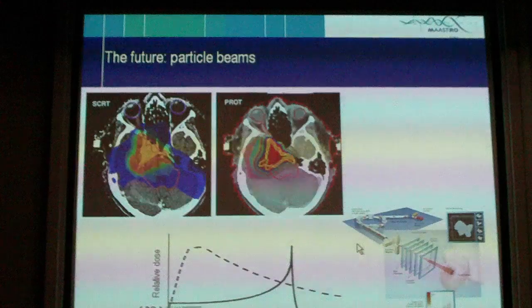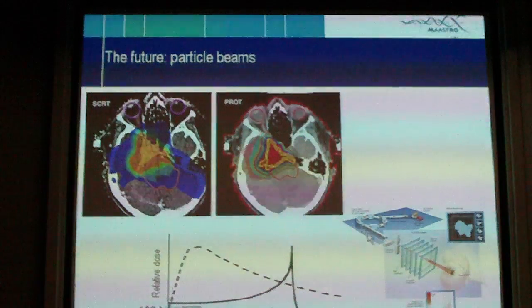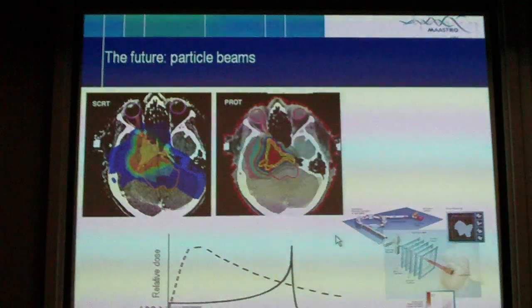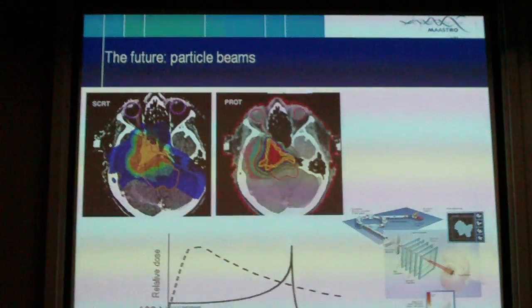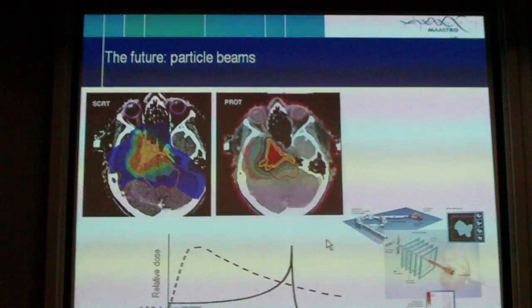So we're building at the moment a proton therapy center over here in Maastricht. This is sort of a very small picture of how it looks. So it will be combined with the tube that they're making on the highway, because there we need to start to generate our protons to get them over here, next door, to get them with sufficient energy level. So yeah, it will still take a while before we can actually treat patients with particle beams or protons.